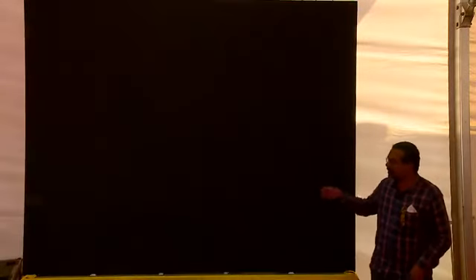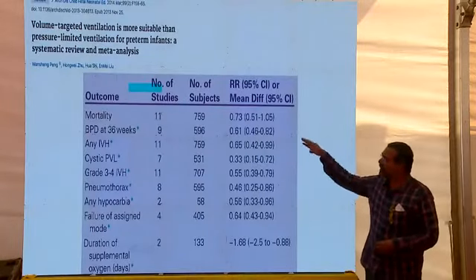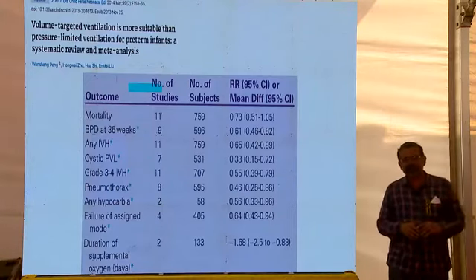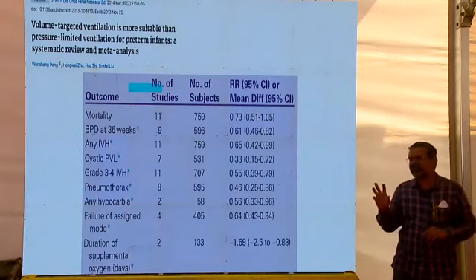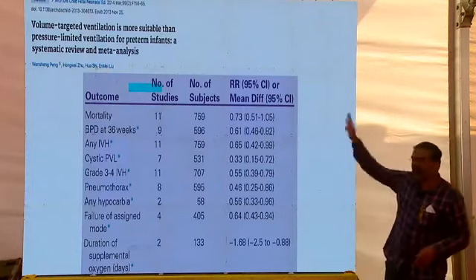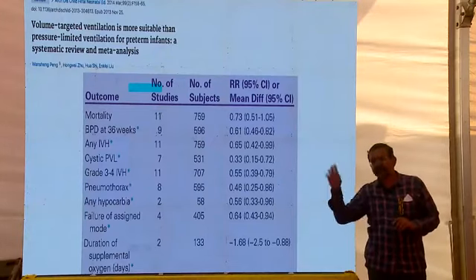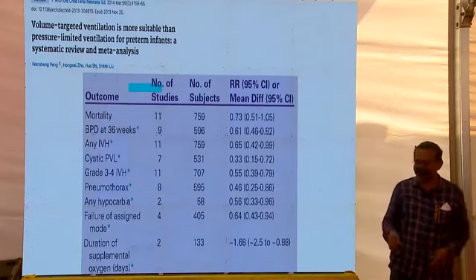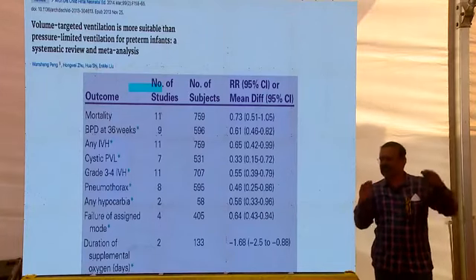So these are the changes, meta-analysis and all those things. There were earlier meta-analyses, but they had very small studies and were not relevant to our practice because they considered a different type of population, and they said that volume is good. Surprisingly, in the countries that reported these studies, pressure is also practiced more than volume. Sometimes people talk differently in conferences and do differently in their own practice. Similarly, neonatal ventilation mainstay continues to be pressure.